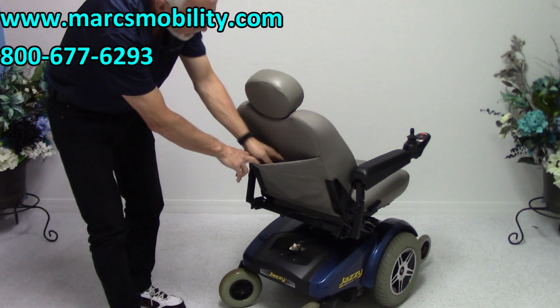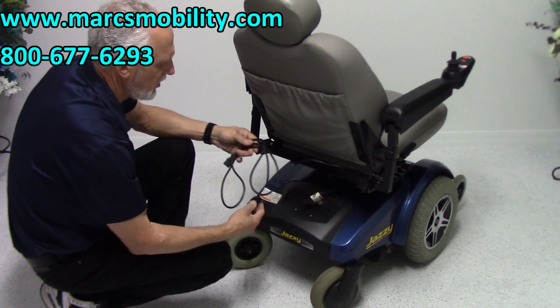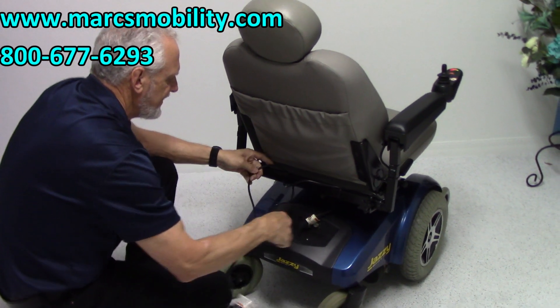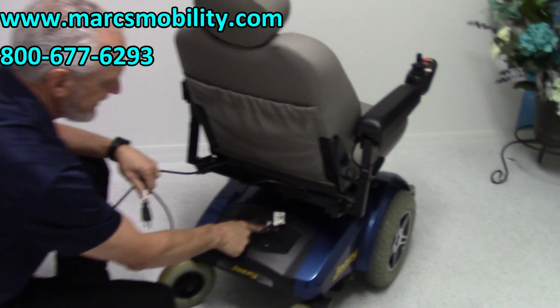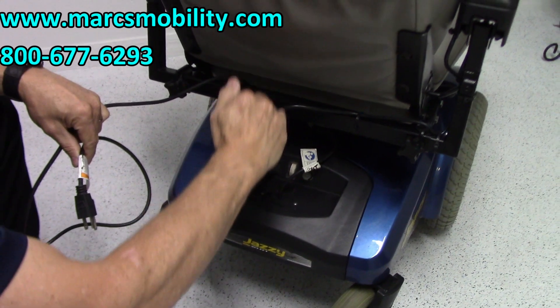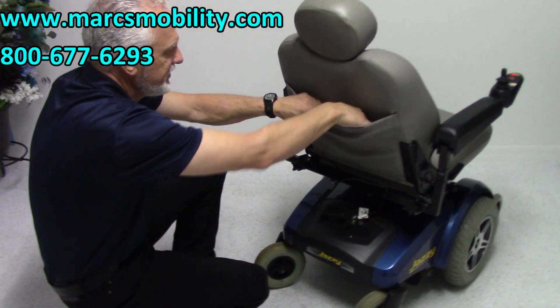This chair has a built-in charger. The charger is built into the back of the chair, under here. All you have to do — a lot of people leave their cord already plugged in — just plug it into the wall. You have an amp meter right here: the needle goes up when it's charging and back to zero when it's full.